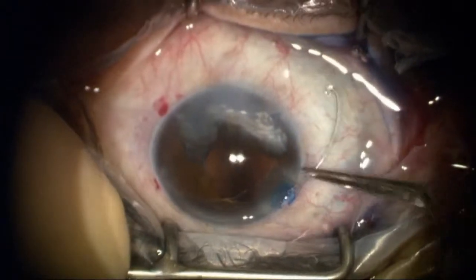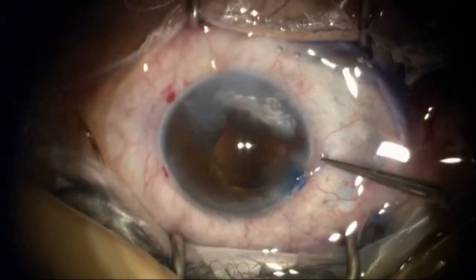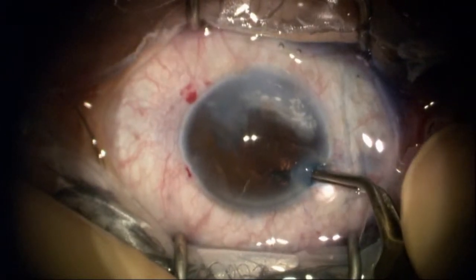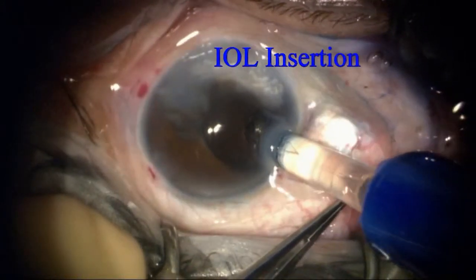This is a capsular tension ring. You can put this in with the injector, but I sometimes like to put them in manually like this — I can get a better feel as to how it's going in, in case I'm not a hundred percent sure about the bag integrity. I don't get that sensory feedback when I'm using the injector.